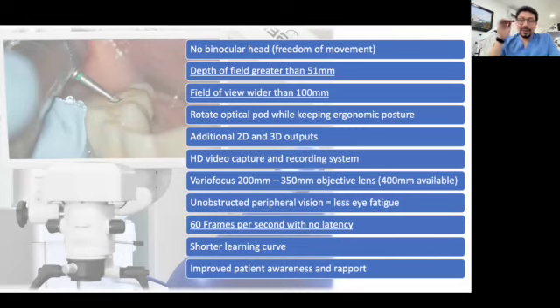If you try to work under the higher magnifications, you are going to be frustrated because the depth of field will decrease a lot, and if the patient moves a bit, you will be out of focus. So it's a common mistake. The dentists decide to buy the microscope, and they try to work under the 5th or the 6th step of magnification, which is 18 to 24x approximately. That is too much.